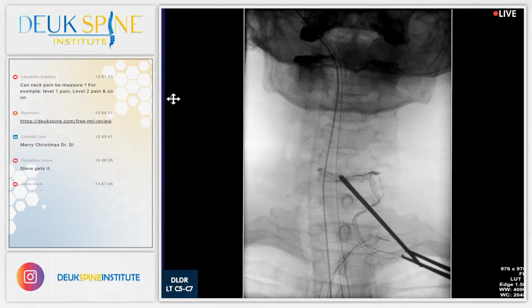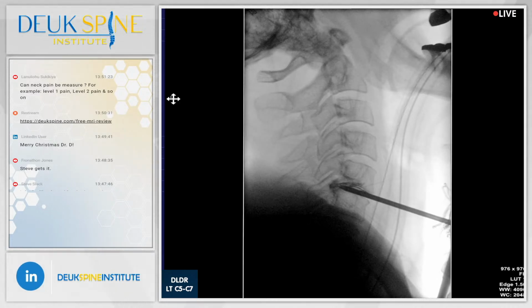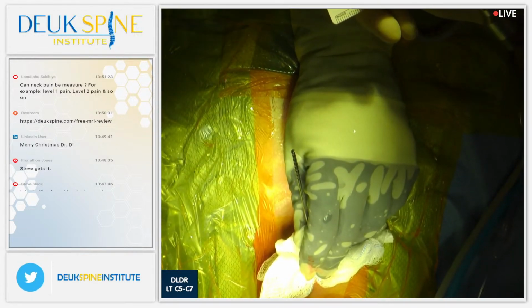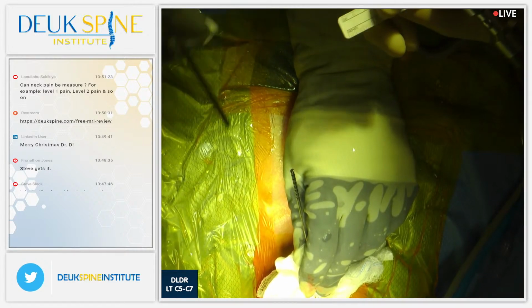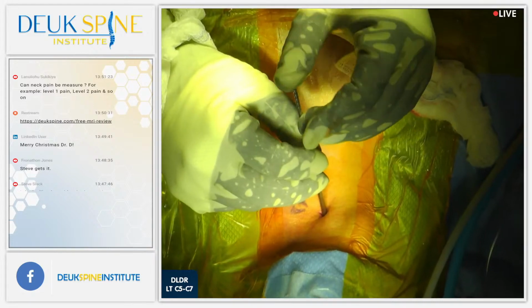Lateral shot. All right. We are now almost at the back of the herniation. A smidgen more. Looks good. We're going to wait. Let me show the audience the whole surgery, folks. Look at this tube. You guys see this, Henry? Yes, we do. The whole surgery I do is inside this tube. It's literally 4 millimeters wide. That's why it's so minimally invasive. We have almost zero bleeding.